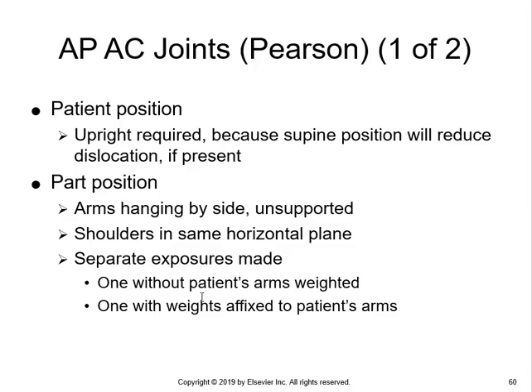Back up to 72 inches so that you have less divergence of the central ray and you're less likely to project those off of the image receptor. If you pay attention to chest x-rays taken at 40 inches, in a lot of cases the shoulders will be projected off of the image receptor. So I recommend you back up to 72 inches.